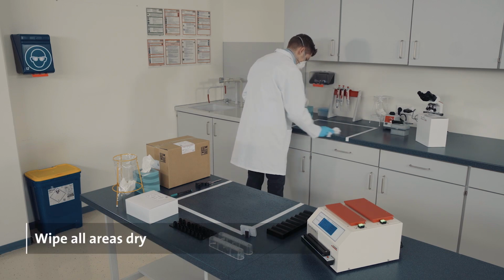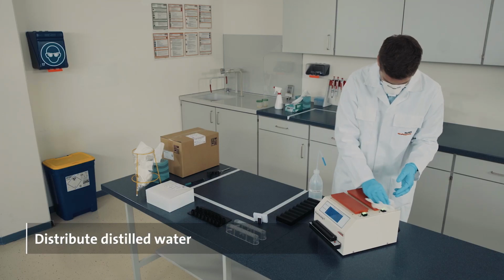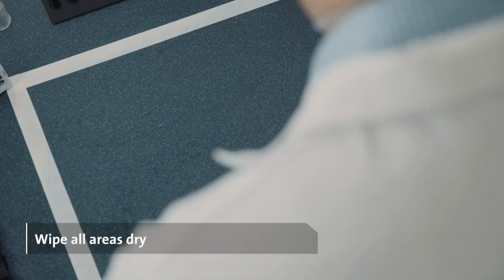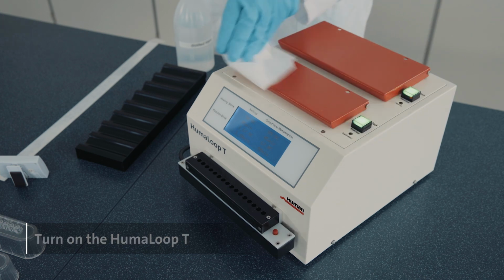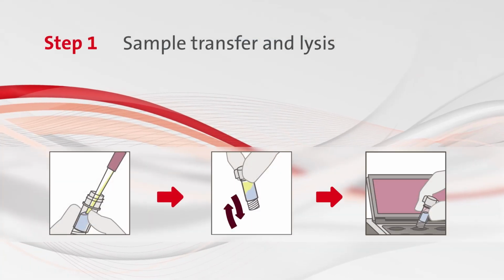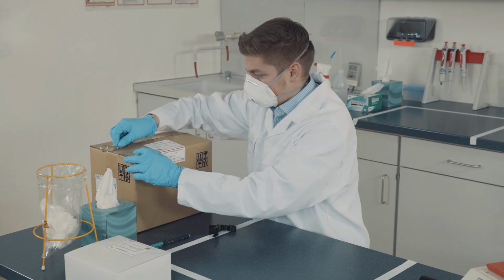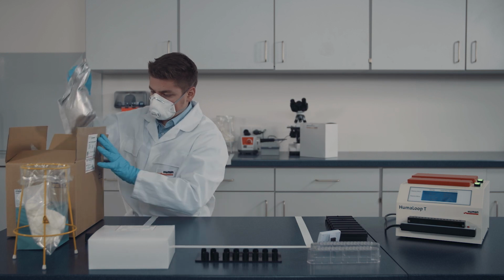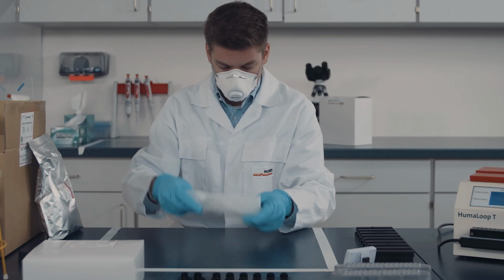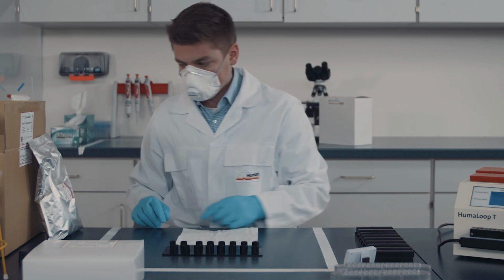Then wipe everything dry. Distribute distilled water to remove the remaining bleaching solution and wipe everything dry again. Now turn on the HumaLoop T to start the heating. Open the Loopamp PURE DNA extraction kit and take out the aluminium bag with the heating tubes. Then lay down a soft cloth on the working area and prepare the rack for the heating tubes.